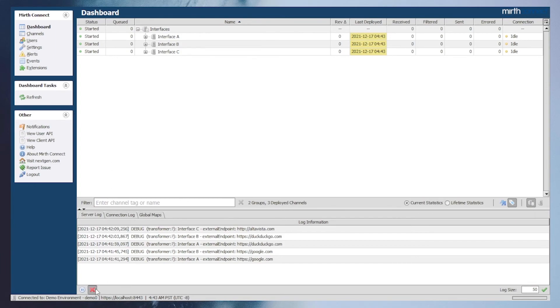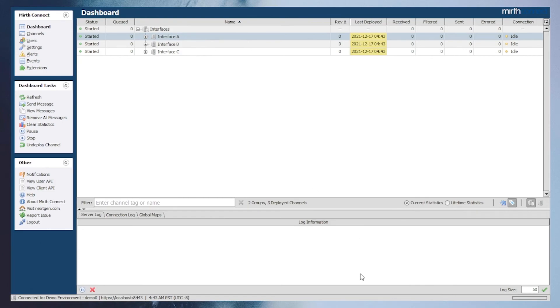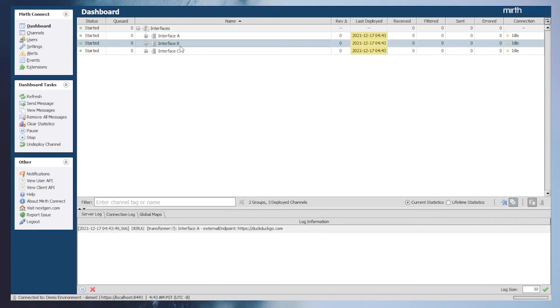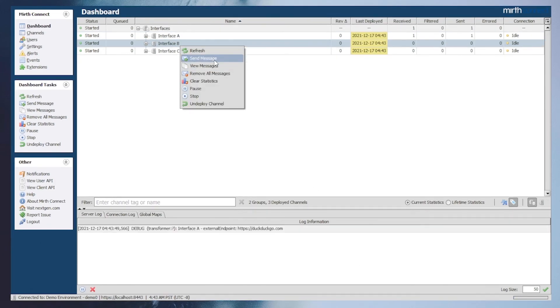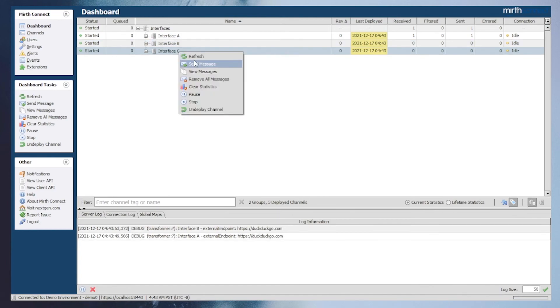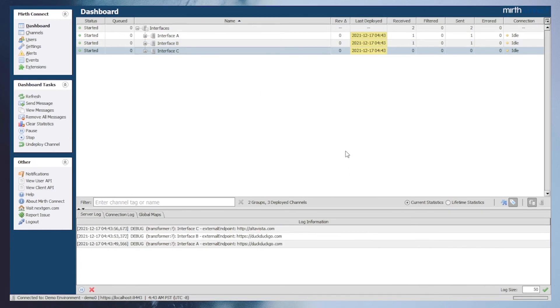After clearing out the logs, we will send a test message to interface A and interface B, expecting the configuration map variable that was reimported. Interface C will print out its overridden value that was set in its scripts.